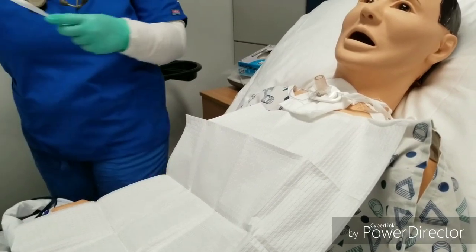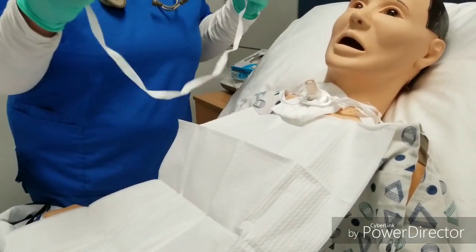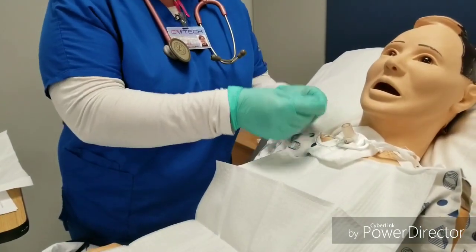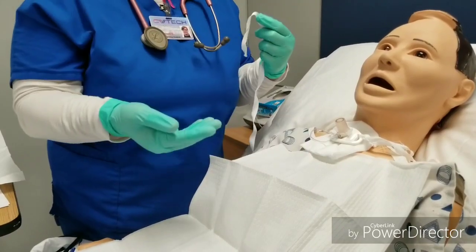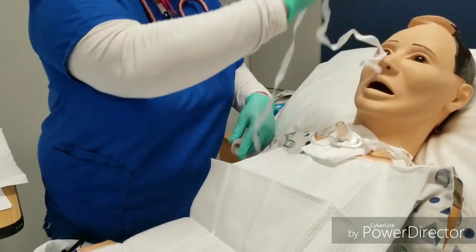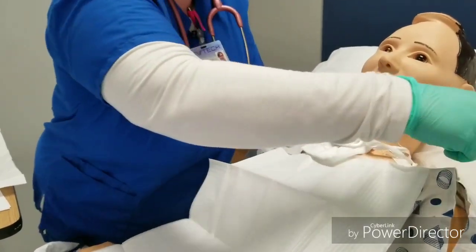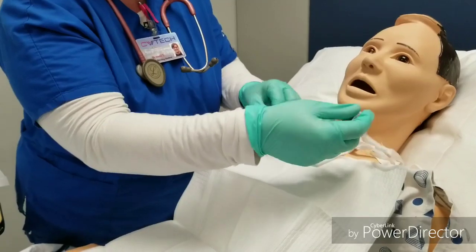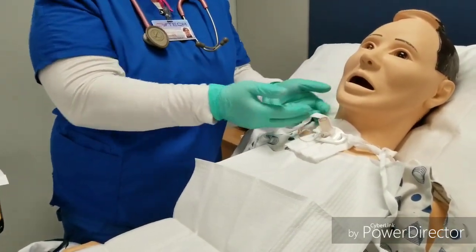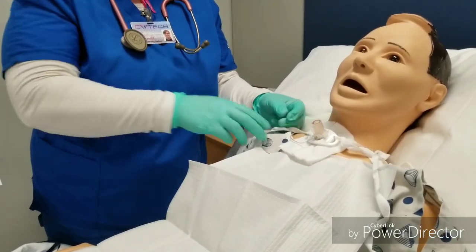And to change out trach ties, we're not going to because these are tied on there pretty good. But if you don't have 2 people to help, you always want to secure the new one before you remove the old one. So you would loop it through and let the patient know you're going to go behind the neck. And then loop it through again. Get it tight. Only 2 fingers should comfortably fit between the tie and your patient. If more than that, it needs to be tighter.